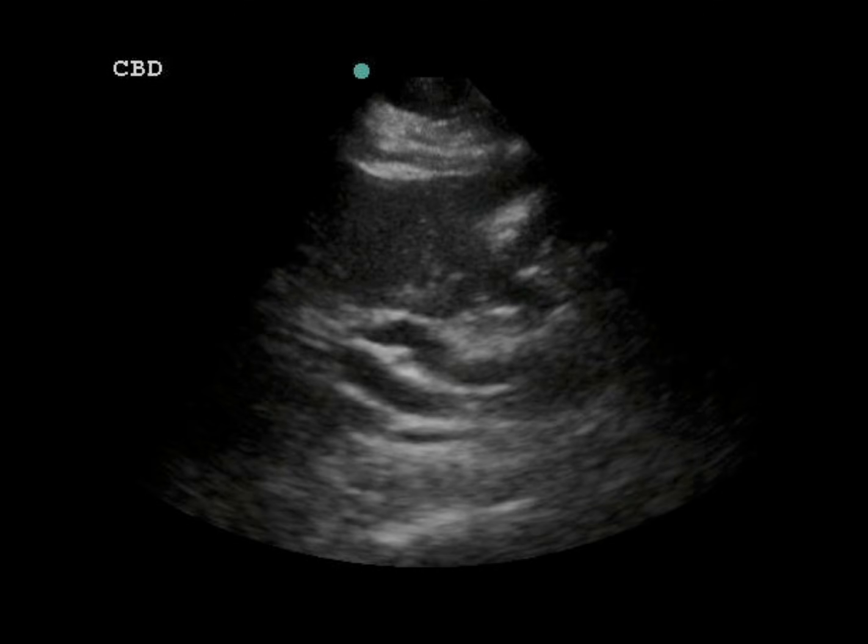Here's another example. I want to show you several because they're not easy. It's not always easy to identify. This is done with a phased array probe. As you notice, our resolution is probably not as good as with the curvilinear, but we do have it there. And what we see in this one is that our common bile duct is laying anterior to our portal vein. It's superior on the screen, but it's anterior in the patient.